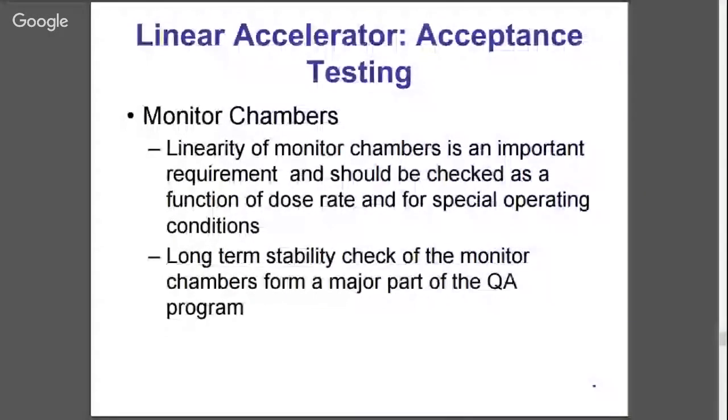And longer term, we need to check the stability of these, because if something goes wrong with these monitor chambers, they're going to affect the output of the machine. Okay, and that's serious.